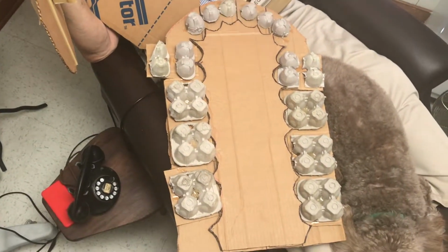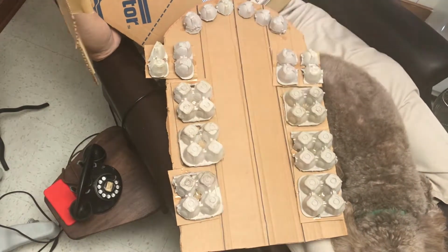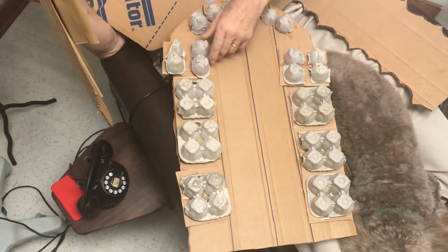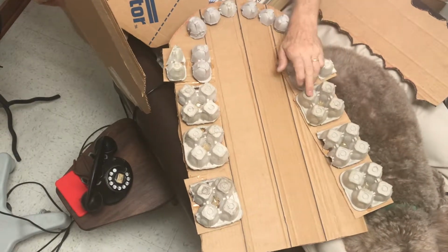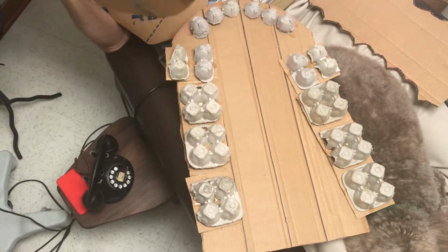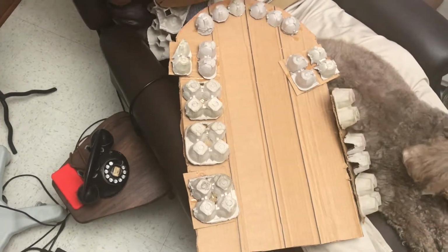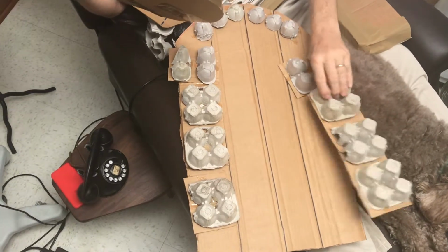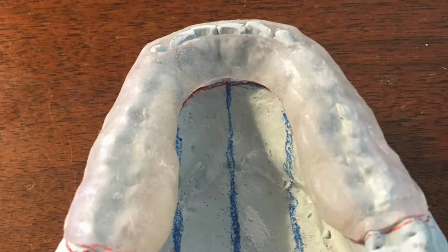So what we do is we restore the relationship that should have been after the bicuspids were extracted, or that the arch or the teeth have been pushed out like that, by putting an appliance in that allows you to take care of and line up the teeth again according to that line.